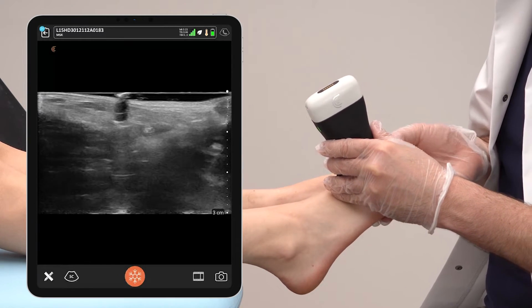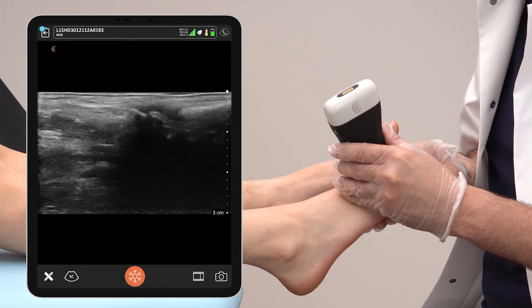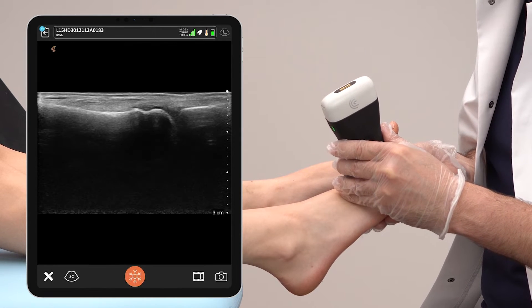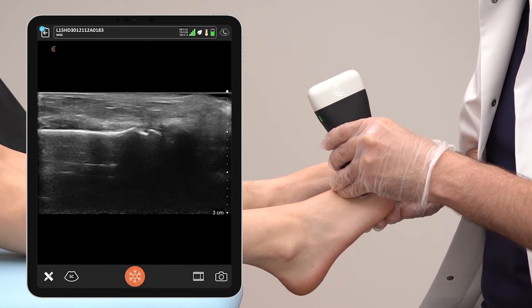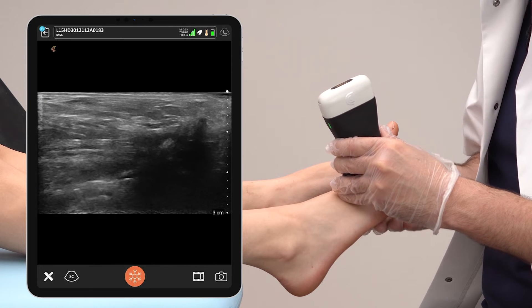First, we shoot with the transducer towards the third metatarsal bone, which can be seen now on screen. Then we angle it towards the fourth bone, which can be seen right here. Now we're going to scan in between.